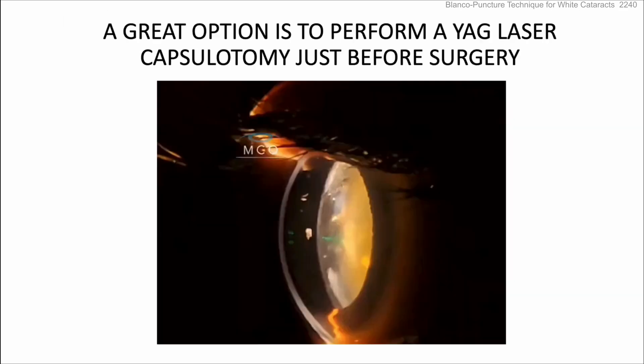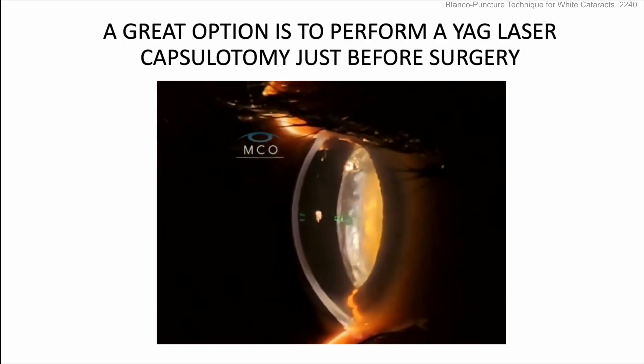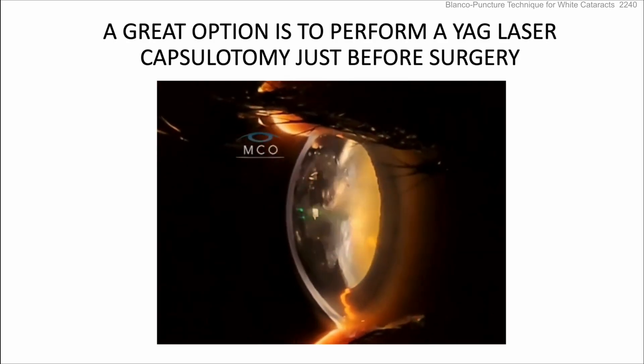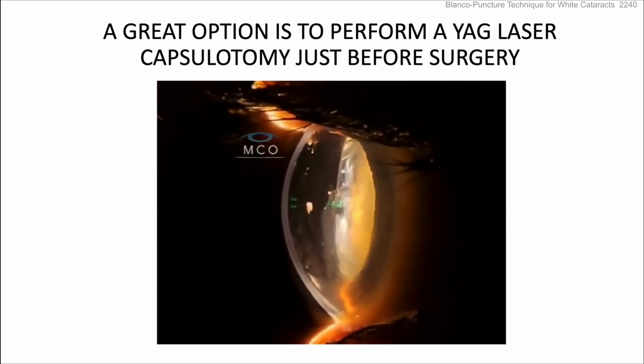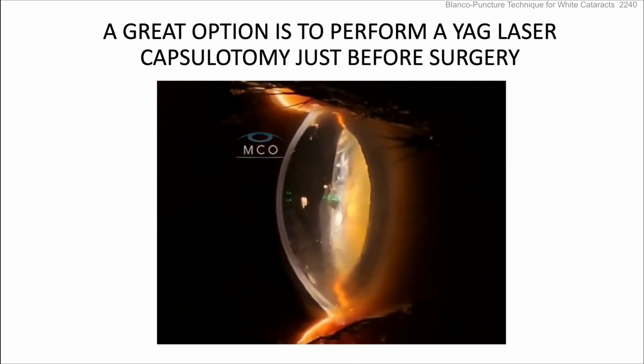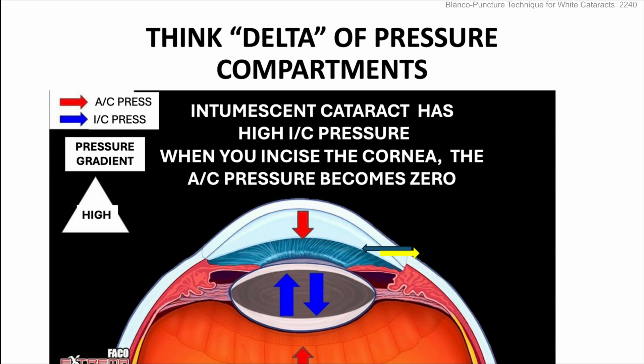A great option is to perform a YAG laser capsulotomy just before surgery — puncturing the anterior lens capsule and giving it time to equilibrate, which can be done in the pre-op period. Think about the delta of pressure compartments here.